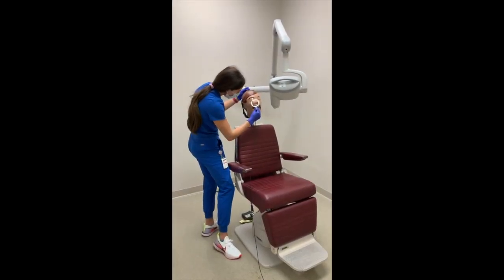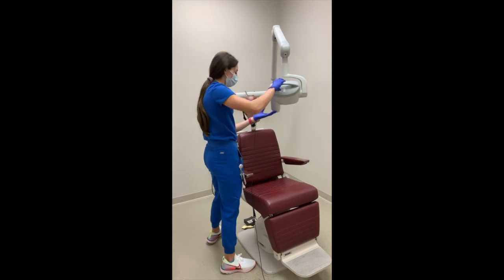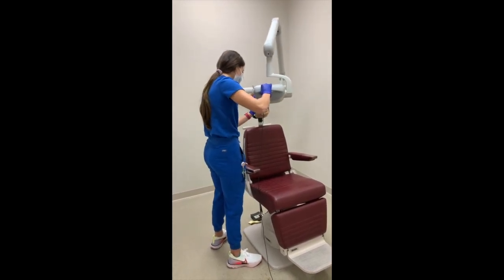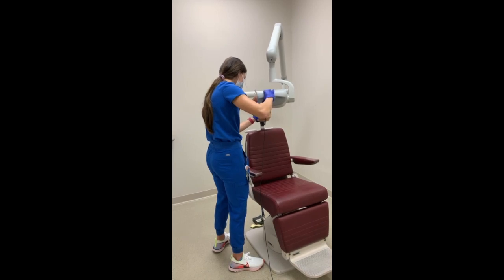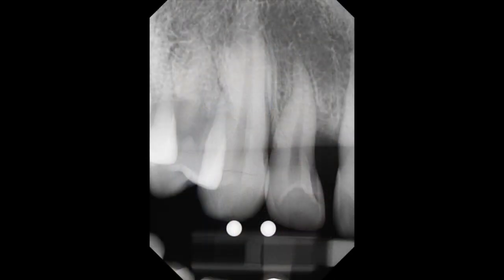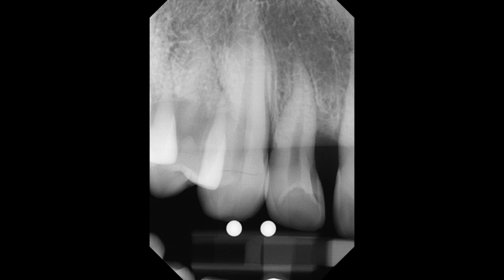Finally, in our third example, the student is attempting to capture a PA of the right maxillary canine. The student has performed all of the proper intraoral techniques indicated for this radiography. When reviewing the captured image, it is determined that the tooth is simply so long that an image will not include the root apex.